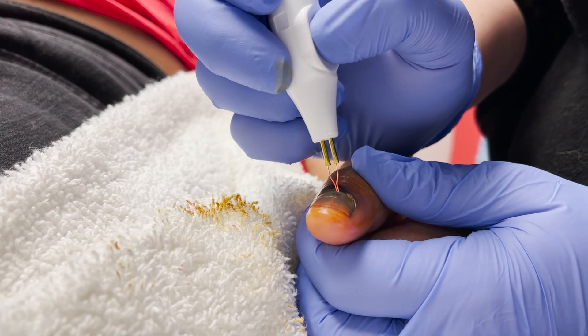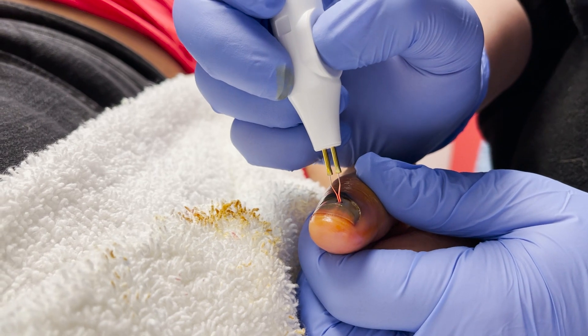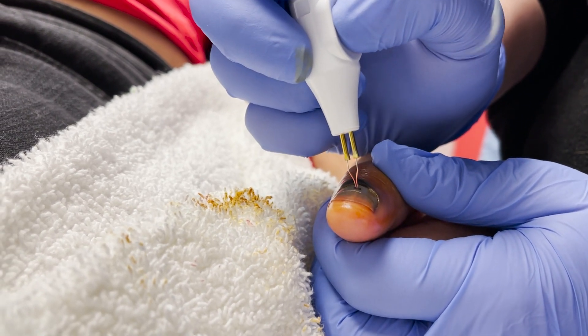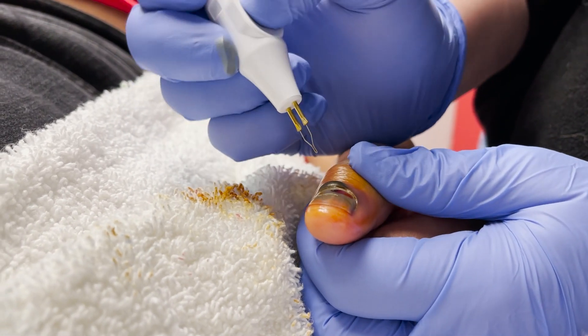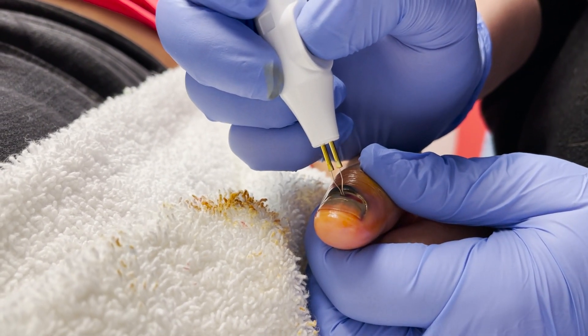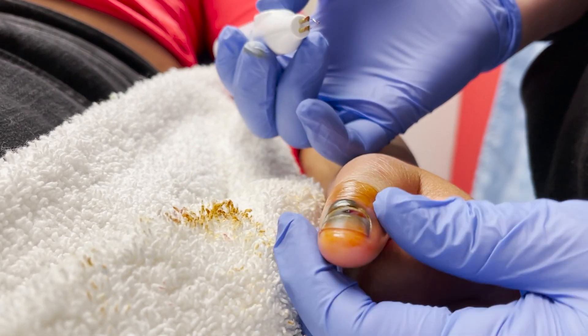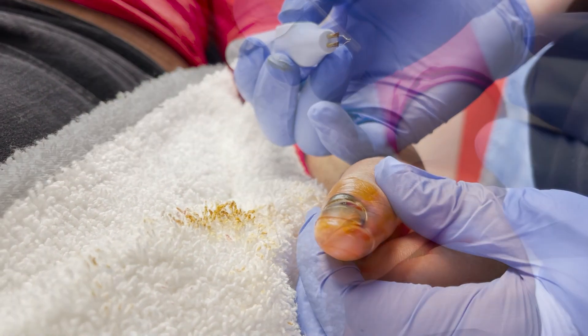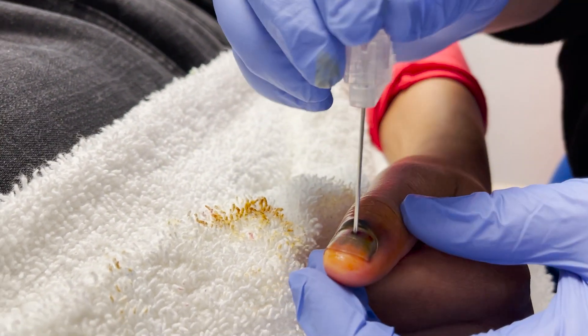You're doing exactly right — just short little touches. What you might do now is get your 18-gauge since you kind of broke through, and then spin it. That just opens your hole a little bit, because the important thing is for this to continue draining.